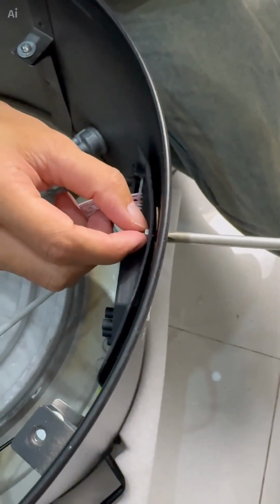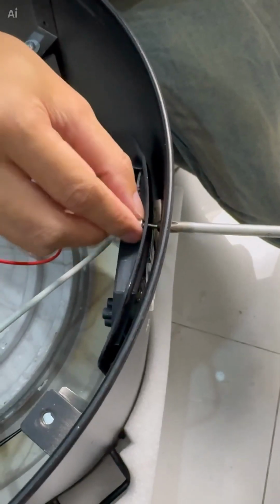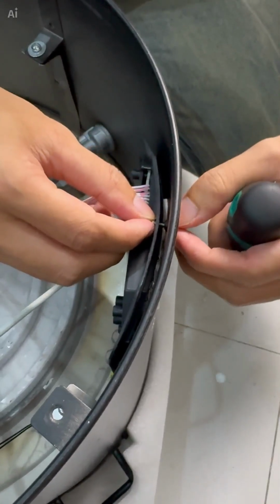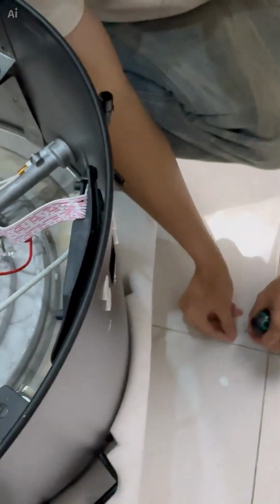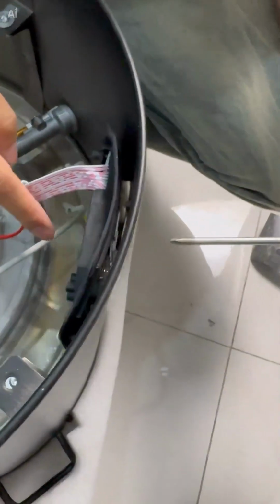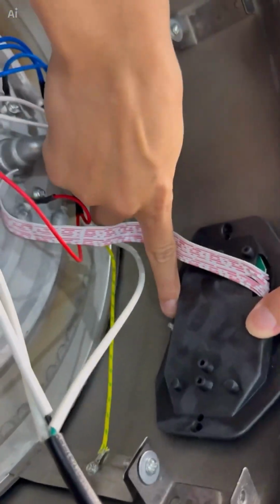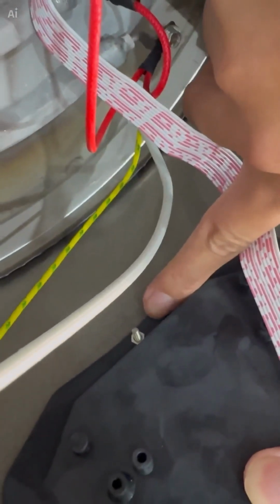Okay, then just remove this screw. Okay, be careful. Make sure not to lose this screw. We will need it later. This screw. Okay, set it aside. Then here at the bottom is the same. There is also a screw and there is a nut at the back.